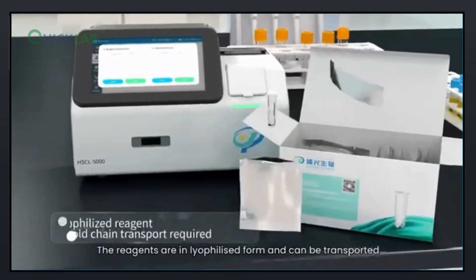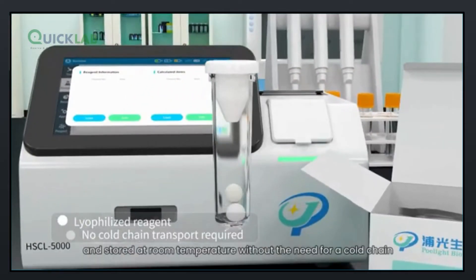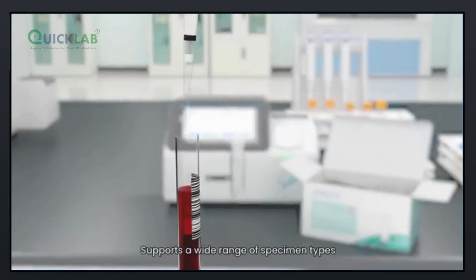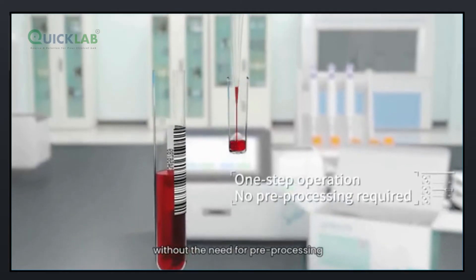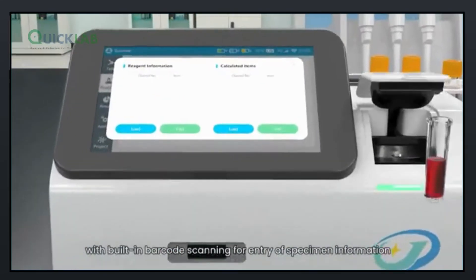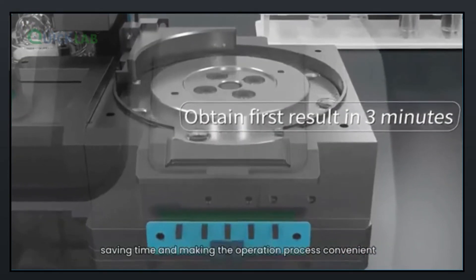The reagents are in lyophilized form and can be transported and stored at room temperature, without the need for a cold chain. The instrument supports a wide range of specimen types without the need for pre-processing, and has built-in barcode scanning for entry of specimen information, saving time and making the operation process convenient.